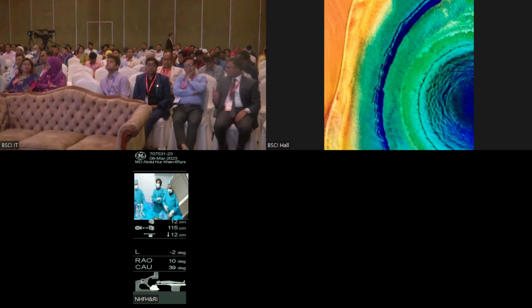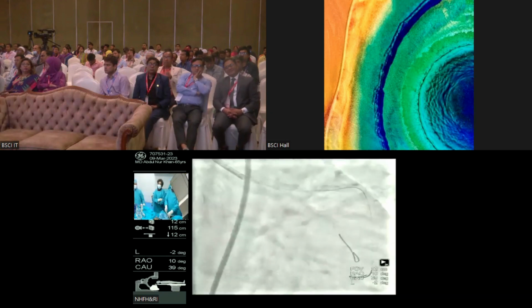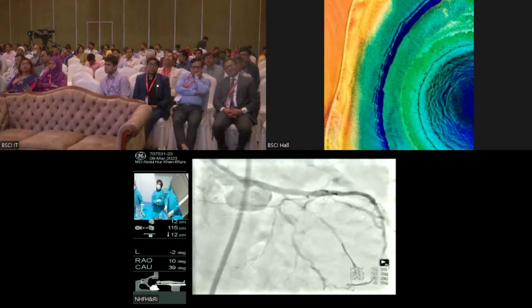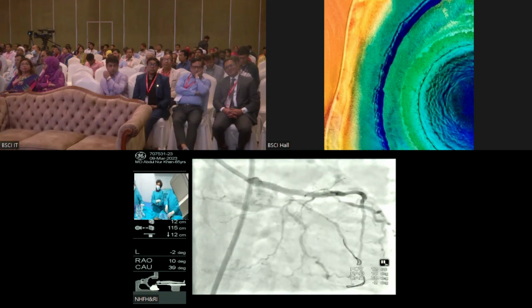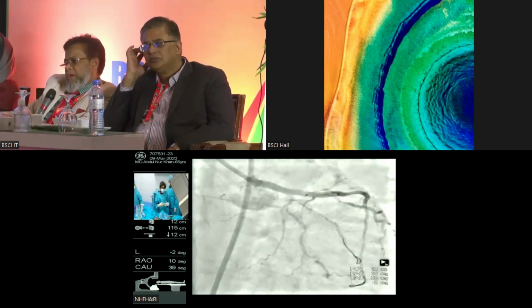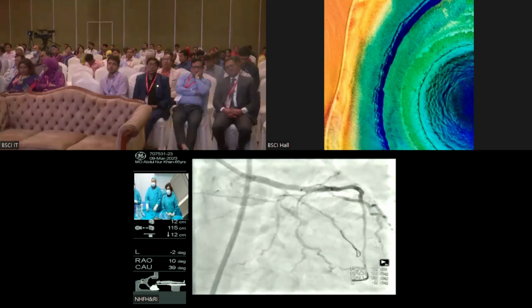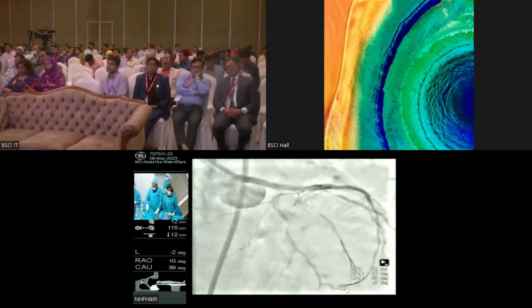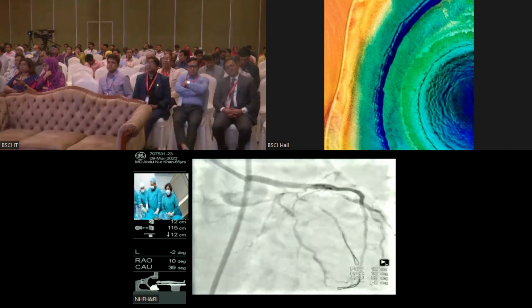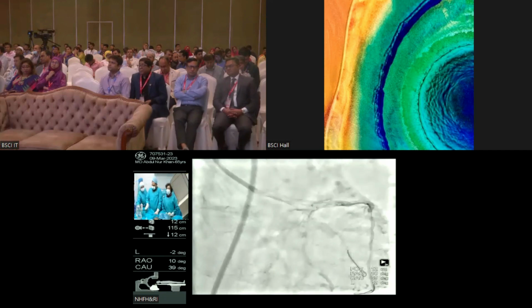Are you planning a post-PCI IVUS? Of course, that goes without saying. We have to do that, because imaging can guide you in the technique that you choose. It can help you with the tools that you want. And lastly, it helps you see whether the result is satisfactory or whether you need further optimization. So imaging can guide you through all the steps, and post-procedure IVUS would be very helpful.